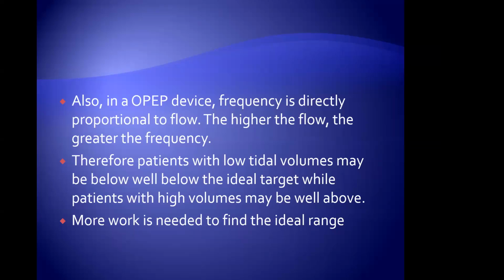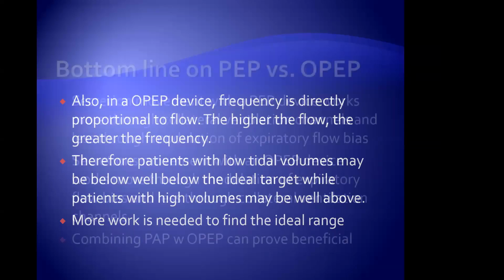We don't do that. We design that. We do the peak flows. We do all of that specific to what is going on dynamically with that patient. So again, OPEP device, a handheld device, specific to that patient. Think about what you're doing.